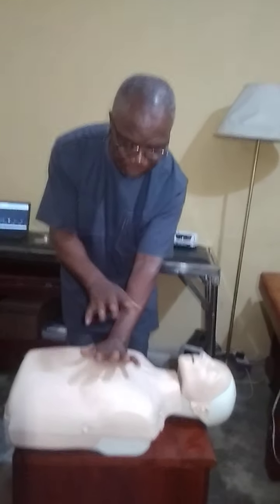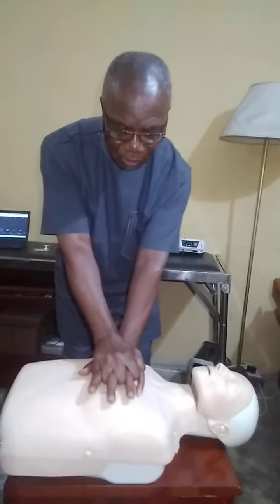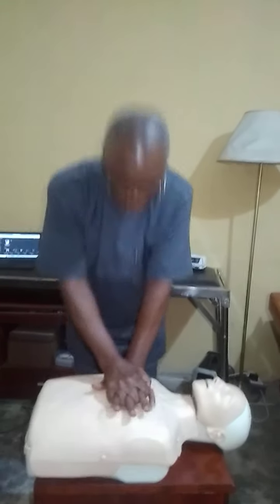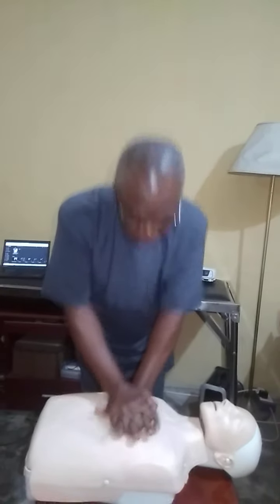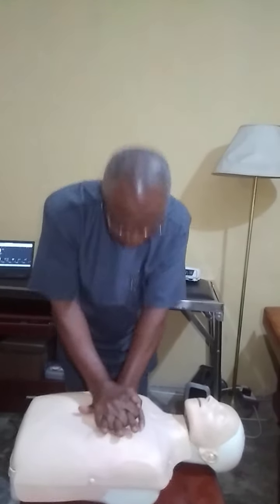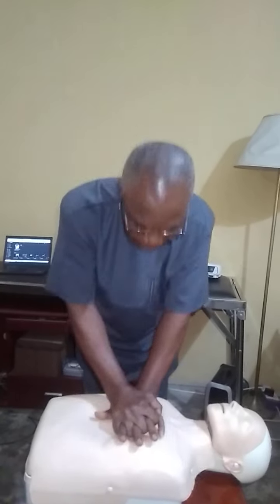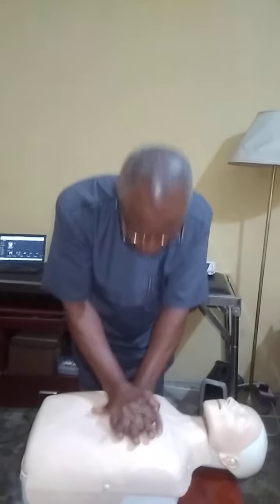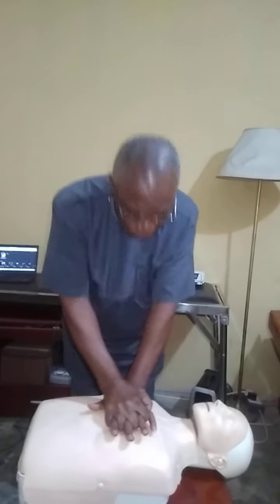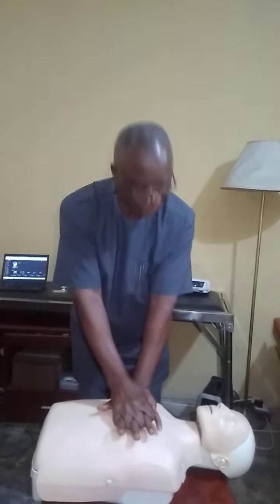My hand is placed. Now go to the top, interlock, and then I will start my count. 1, 2, 3, 4, 5, 6, 7, 8, 9, 10, 11, 12, 13, 14, 15, 16, 17, 18, 19, 20, 21, 22, 23, 24, 25, 26, 27, 28, 29, 30.